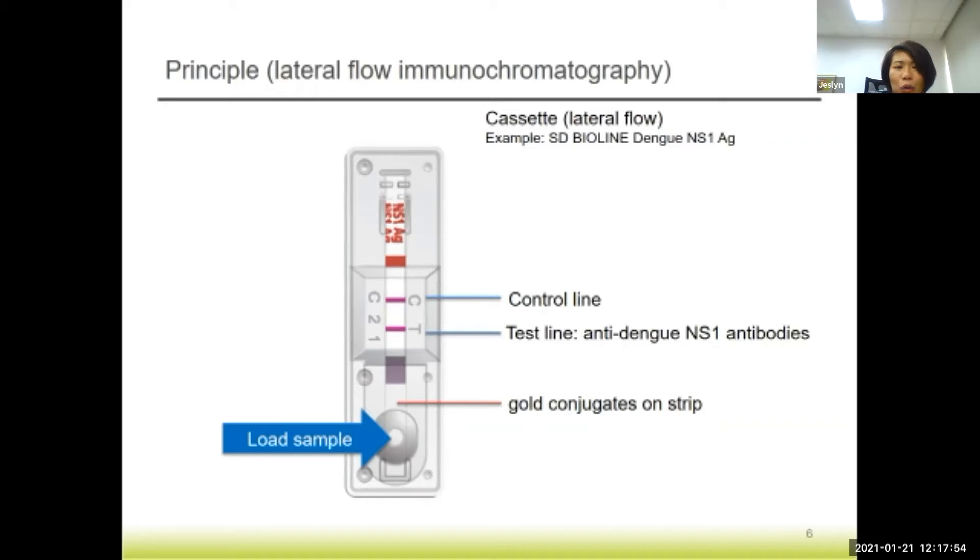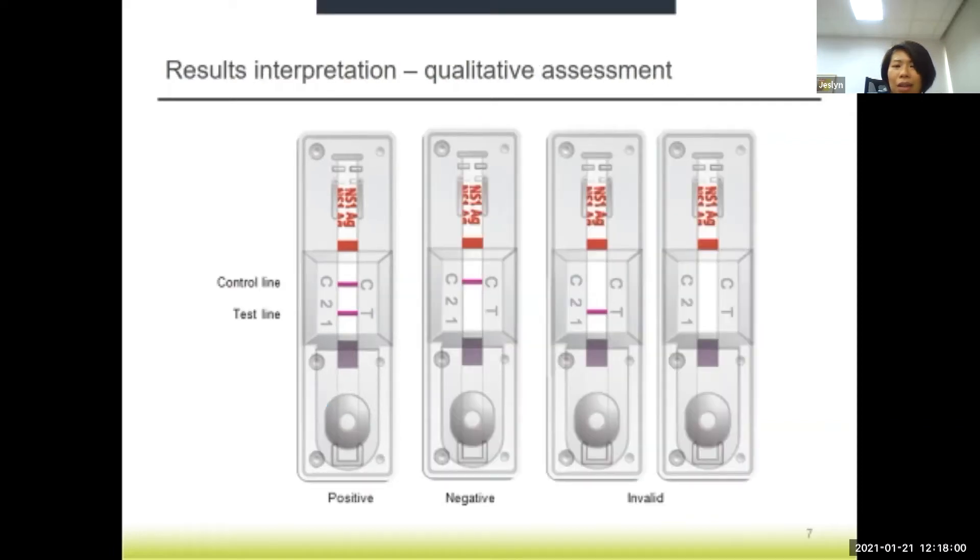In the event that the control line does not appear, the test is considered invalid and has to be repeated. As you can see from the examples here, for a test kit to be valid, the control line must be present. The presence of a test line indicates that your sample is positive for dengue. Even if the test line is present but the control line is absent, the test kit is invalid. And if no lines appear at all for both the control and test line, the test is also invalid.